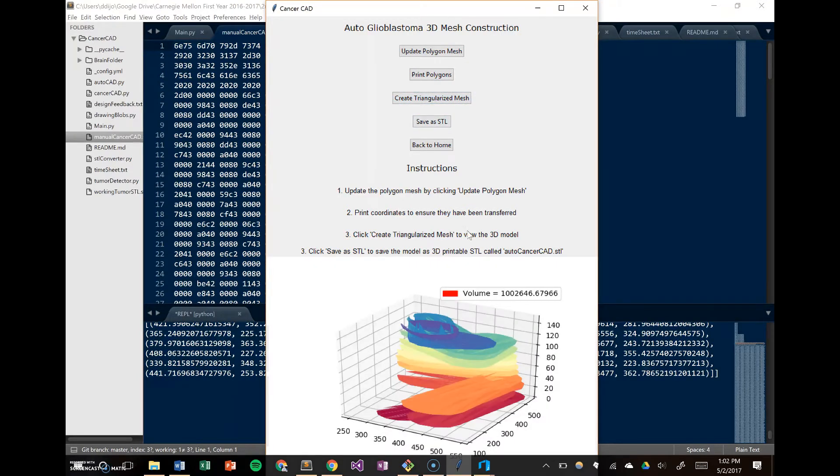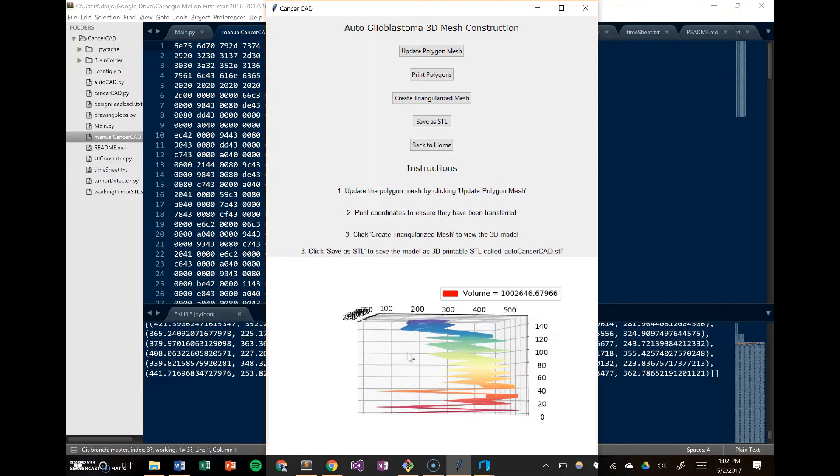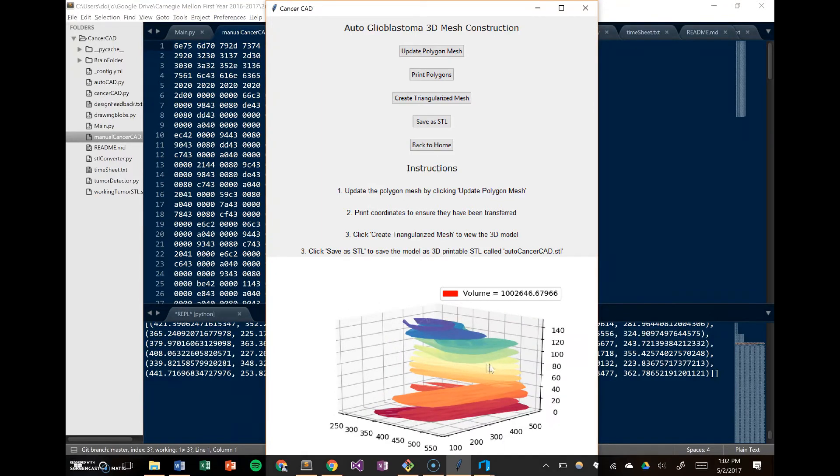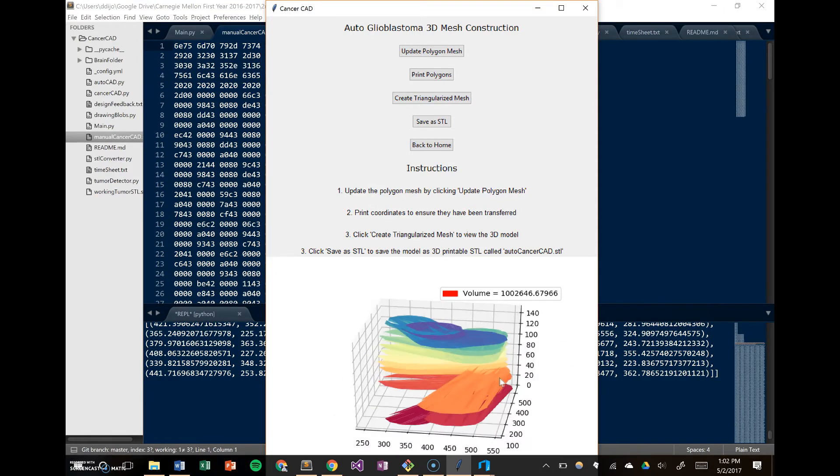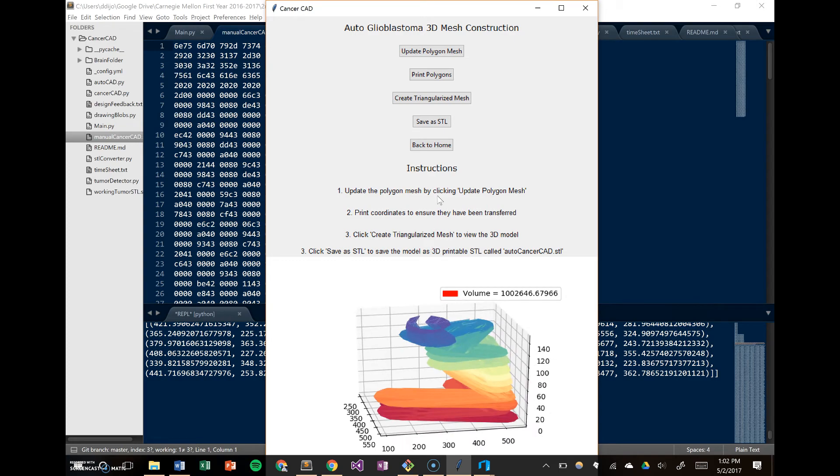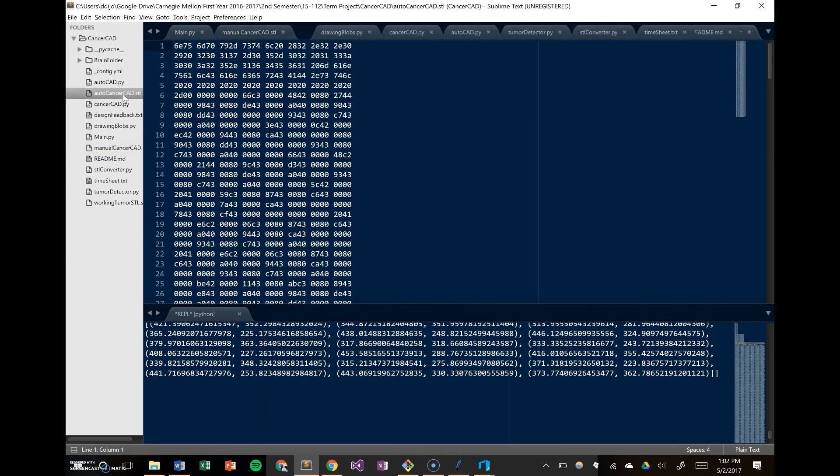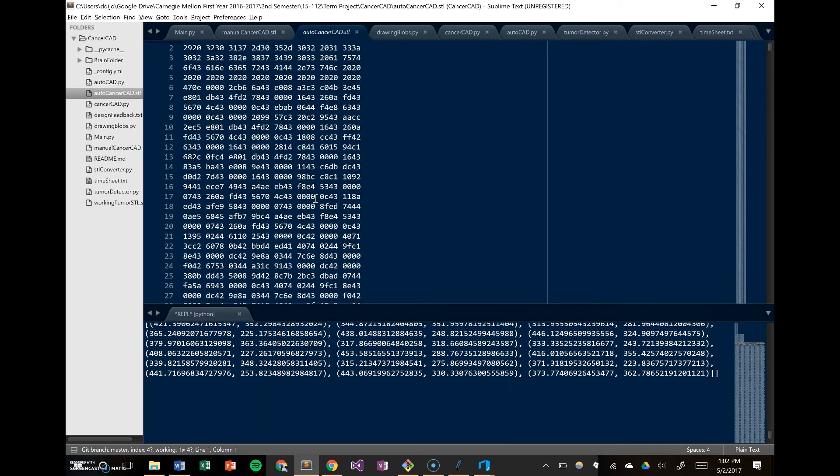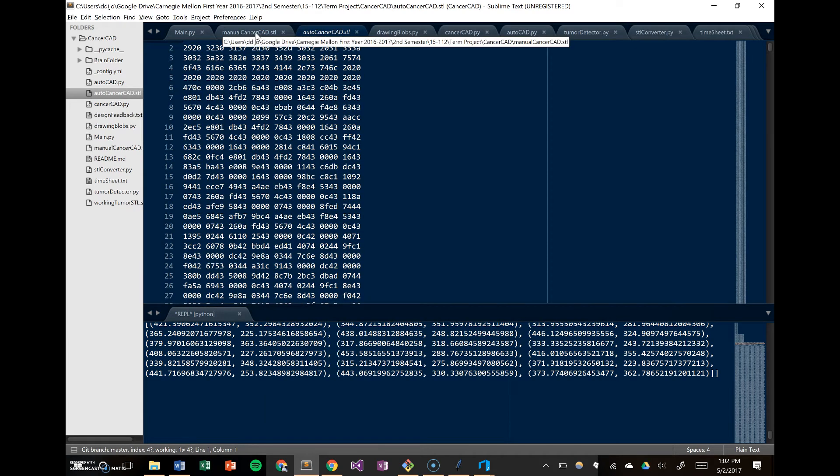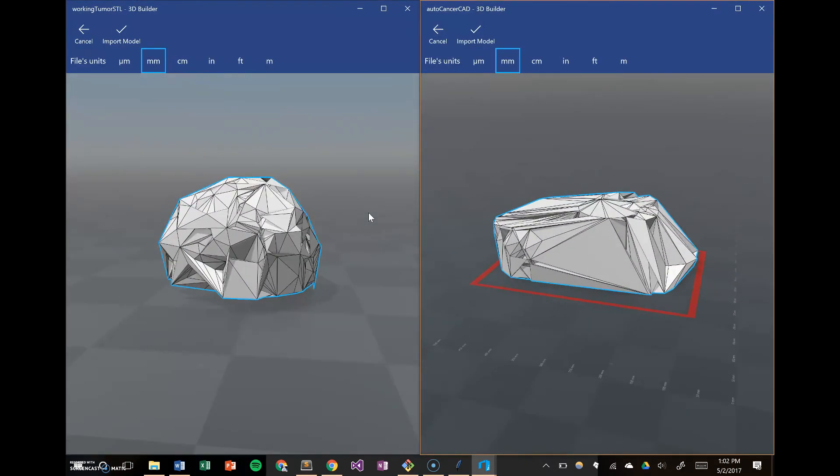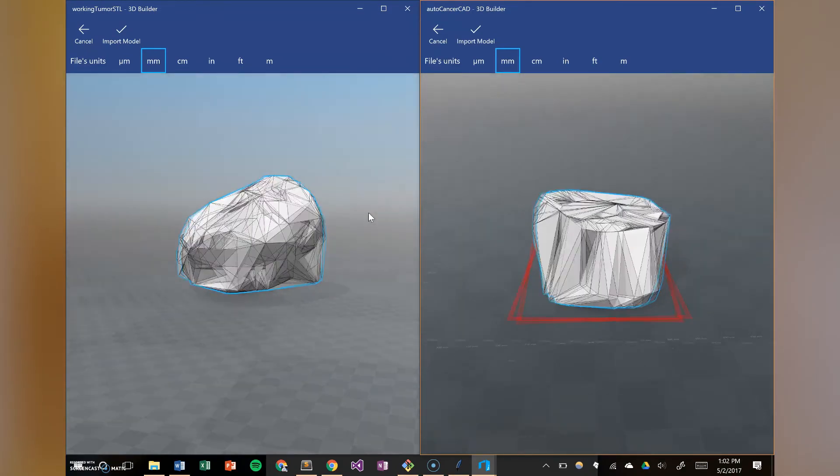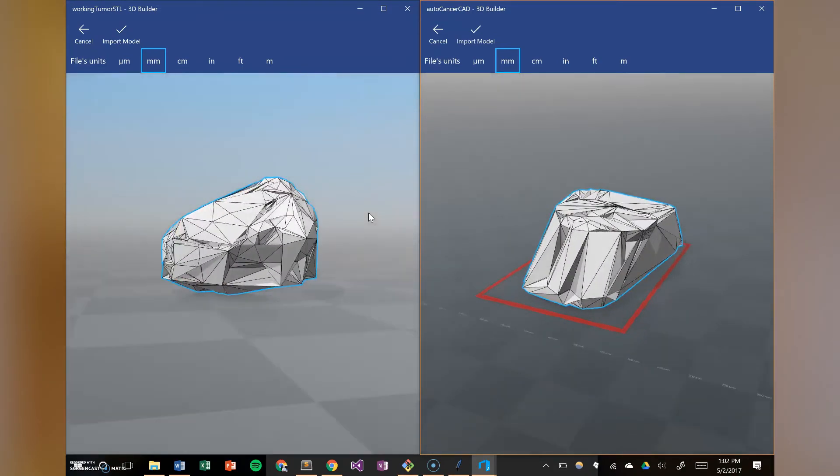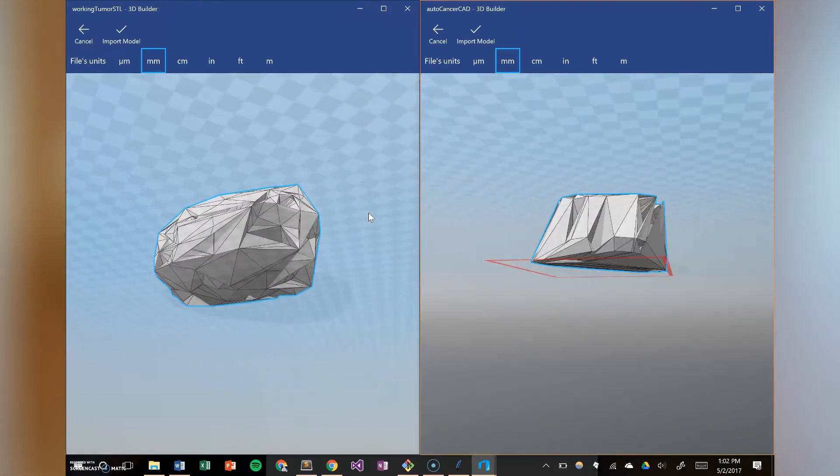The mesh that's constructed here is not actually that indicative of what the 3D object looks like. When you take a look at the 3D object, which is generated the exact same way, you notice a lot of similarities between the intelligently generated STL and the manually generated STL if the doctor went through every single slice. You can see that the 3D printed objects are pretty similar in size and have a similar shape.